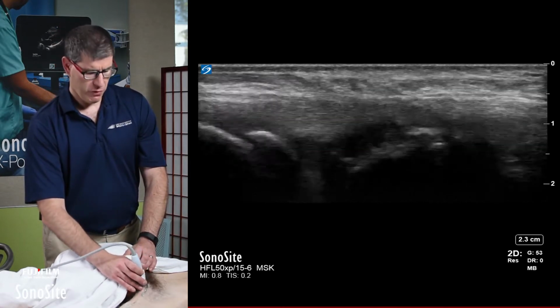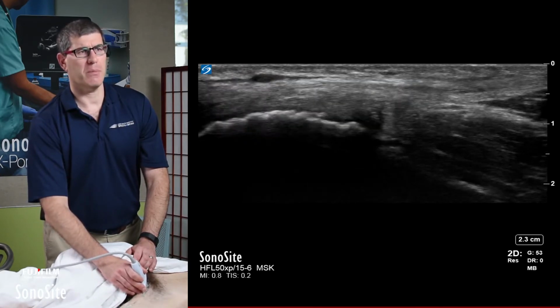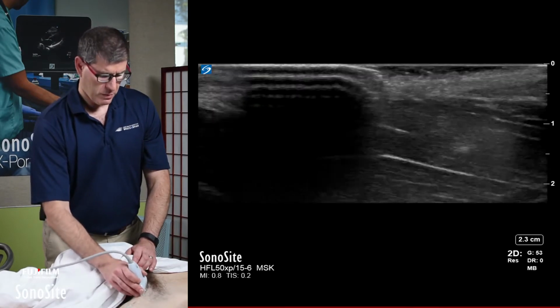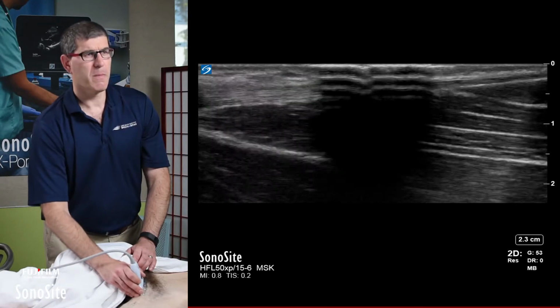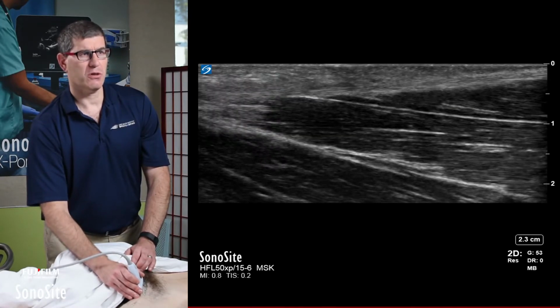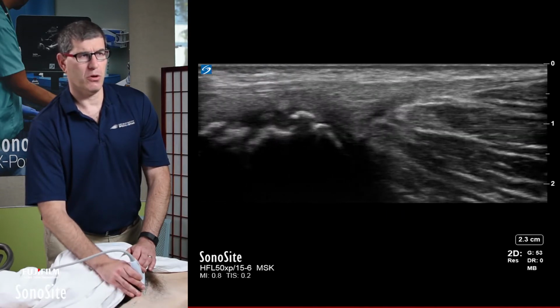Now I'm going to move out a little bit more laterally, so I am now looking at the patient's adductor musculature, going into the adductor tendon, going into the pubic tubercle.